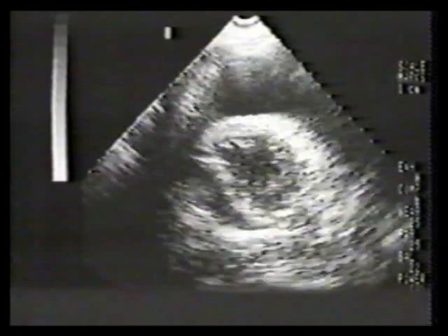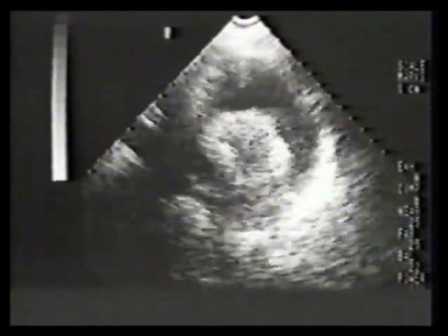They're usually incidental findings after this initial presentation of cardiac tamponade. The tumor is extremely malignant, and death usually occurs within a few months after diagnosis. Note in this example that the cardiac chambers are compromised. The swinging motion of the heart is typical of tamponade in a young man.